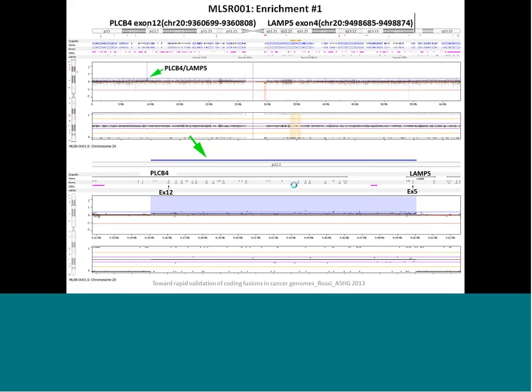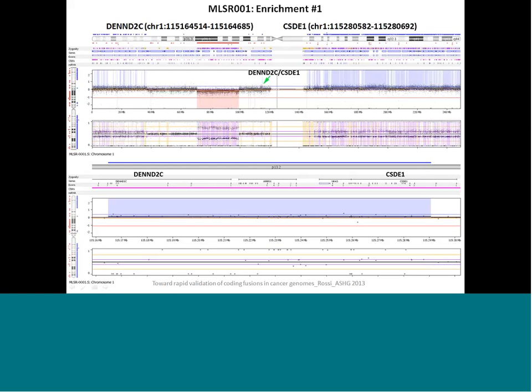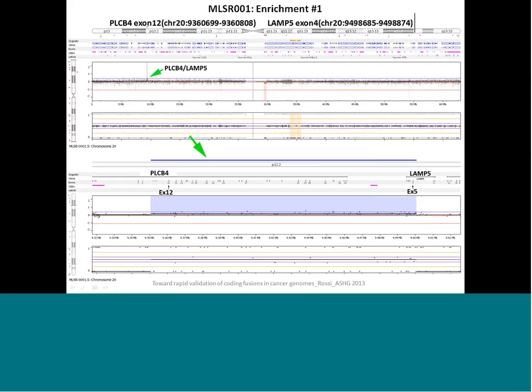We had another one very similar to this on chromosome, this was within one chromosome arm, and this shows a fusion. And sometimes you have these copy number abnormalities that create a false fusion that's actually a benign change. And then you have these other changes within another chromosome, so this is chromosome 20, where you have these copy number abnormalities, and it's really hard to tell: is this caused by a somatic change, or is this caused by some type of benign constitutional abnormality? The context of what's happening in these changes is very hard to interpret.